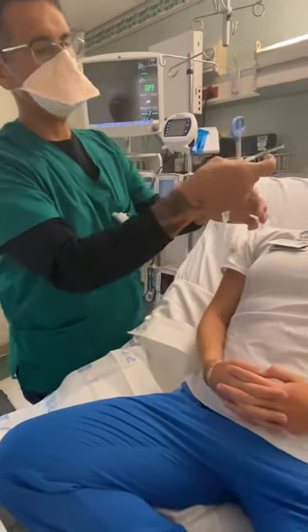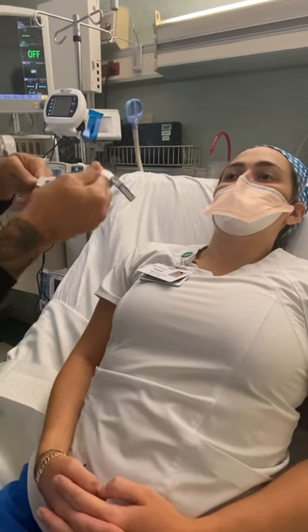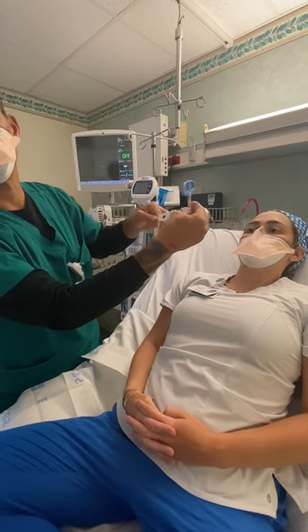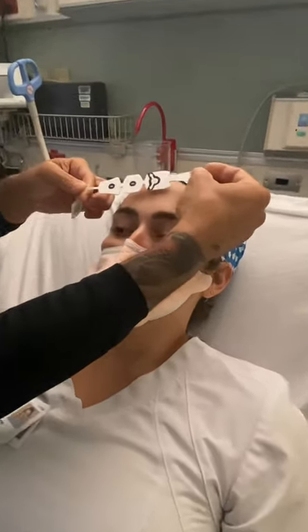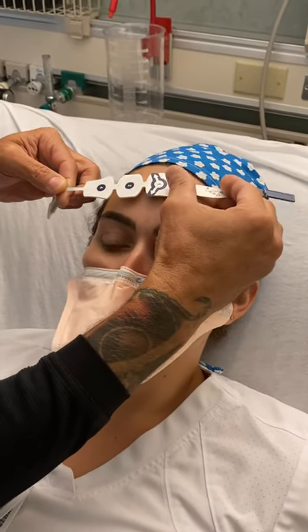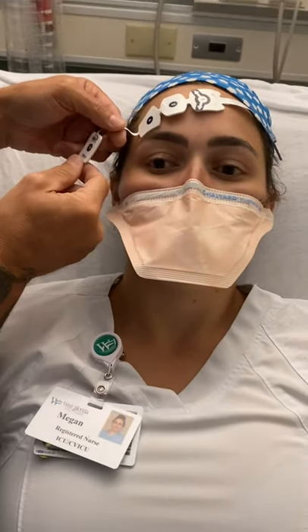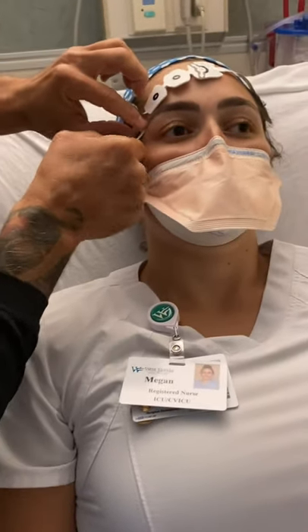Now, the number one has arrows. Those arrows have to go straight down midline. So when you put this first one on, it lines up with the patient's midline, about 2 inches above the bridge of the nose. You see how the arrow is pointing straight down. When you do that, 4 needs to be above the eyebrow, anywhere above the eyebrow. It doesn't have to be in the middle of the eyebrow. And then 3 you can move around, because 3 goes on the temple, so I'm going to put that on her temple.